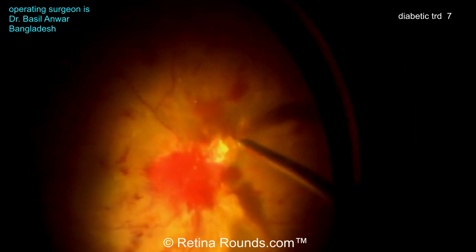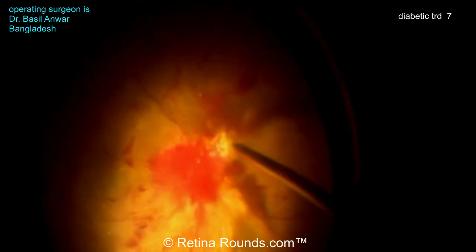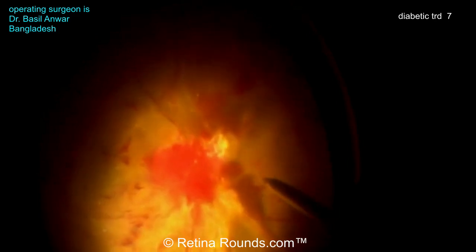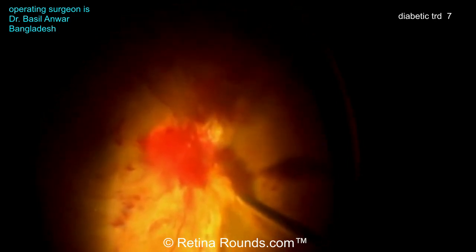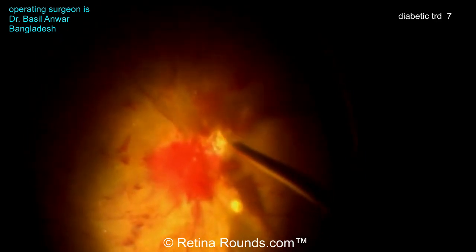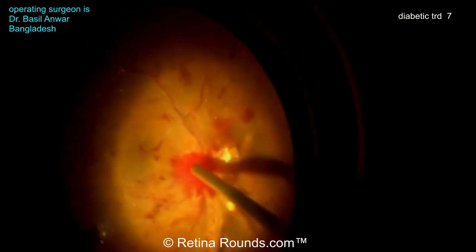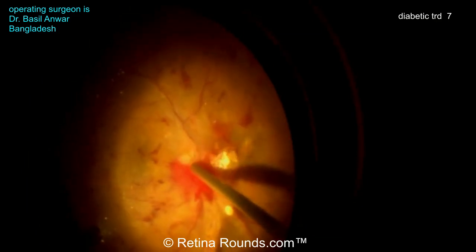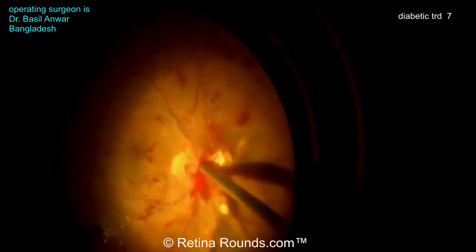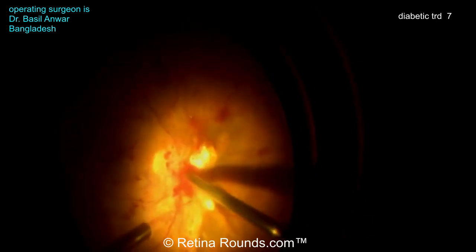It looks like there's some cautery being done here — there may be some oozing vessels. Using the cautery is important. You have to be able to go back and forth between the cutter, forceps, and cautery to deal with oozing vessels. If you don't deal with oozers throughout the case, that blood, which is very rich in fibrin, can almost be like another membrane you have to deal with. So it's really important to deal with hemostasis as it arises, not waiting too long and potentially dealing with yet another membrane to lift off the retinal surface.